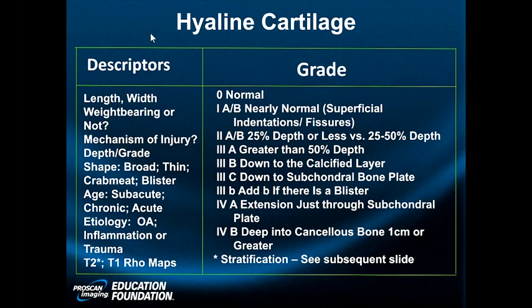That's fine to use. But if you look at this system, one thing it does is it tries to assess depth. So I like to try and decide less than 50%, greater than 50%. If it's greater than 50%, has it penetrated the osteochondral plate? Now, when you have really high resolution imaging, you can even get a little more specific than that, but it's often unnecessary. At the bottom of this slide right here, you see something called stratification.